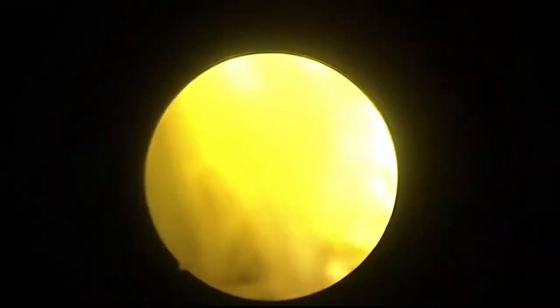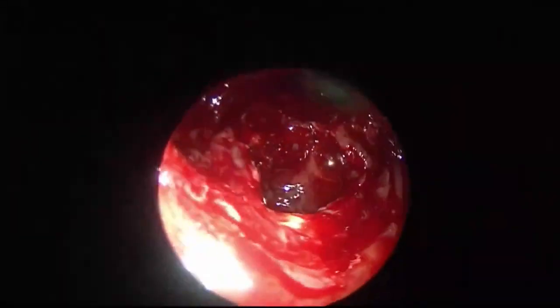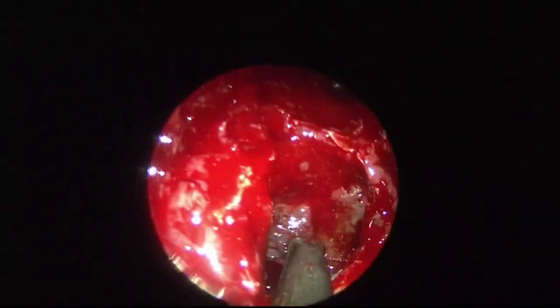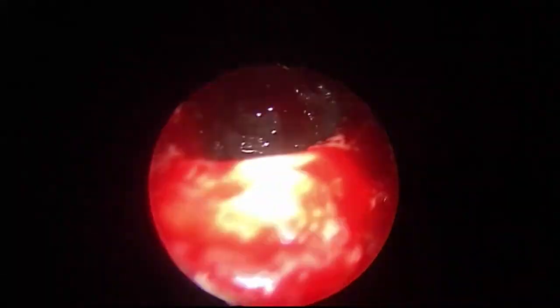Yeah, I can see suction. Some fungal material still in the anterior recess. See with the 70-degree. Could you see this? Yes, yes, can see that. That is a difficult zone to see with a 0-degree.